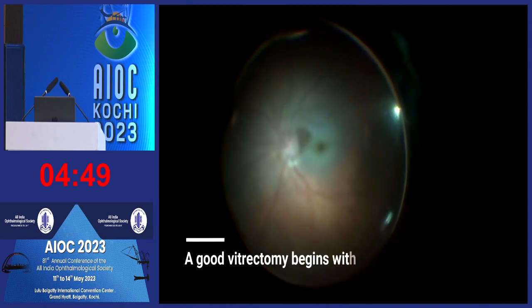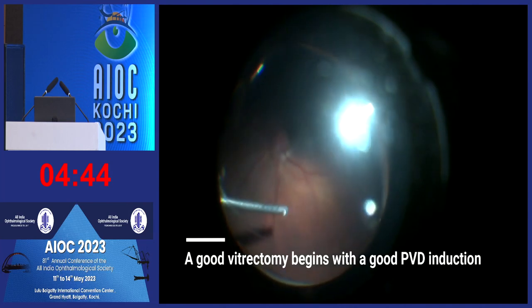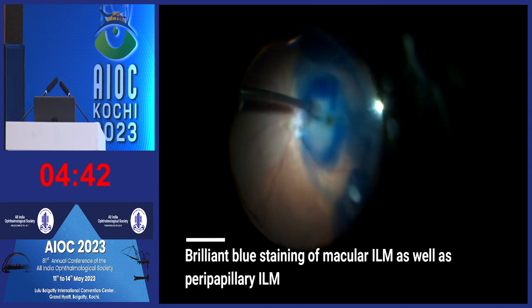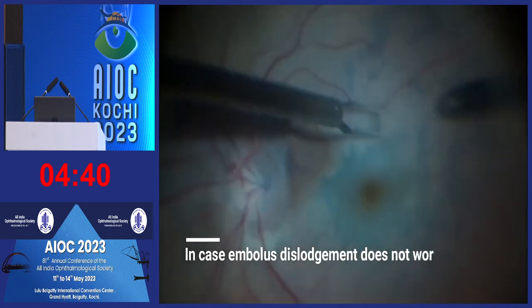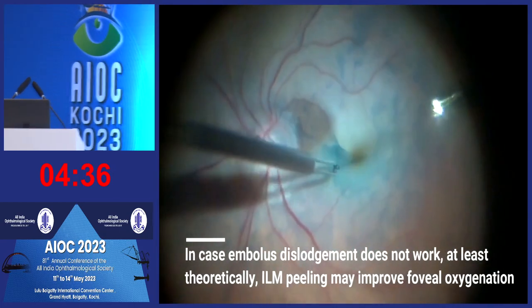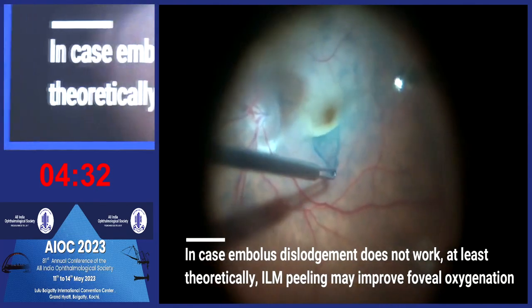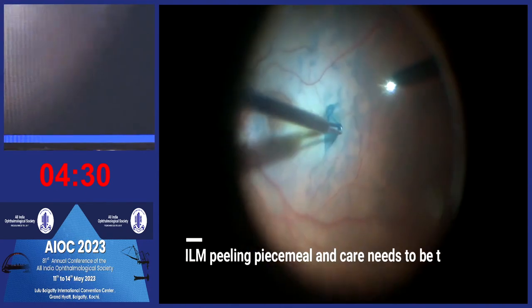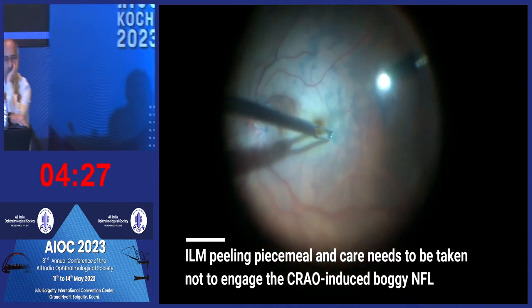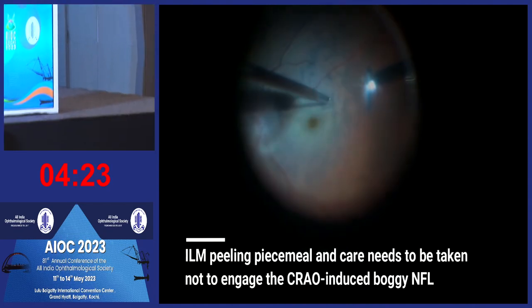Normally there is no treatment for this, but we decided we'll have a go at it. We started by inducing a PVD, stained the ILM and peeled the ILM, in the hope that if we're not able to dislodge the embolus per se, we will anyway improve the oxygenation of the macula by peeling off the ILM. We need to be careful while peeling the ILM. As you see, the retina here is very edematous, the macula is boggy, and there is every chance of the macula getting caught in the forceps as you are peeling the ILM.